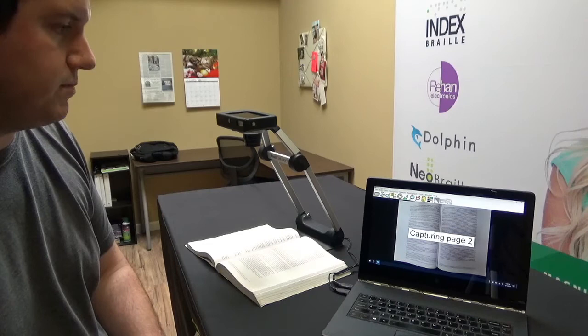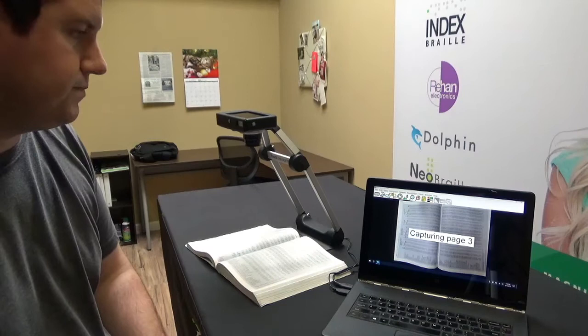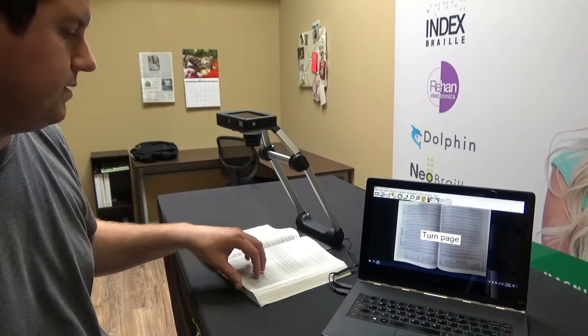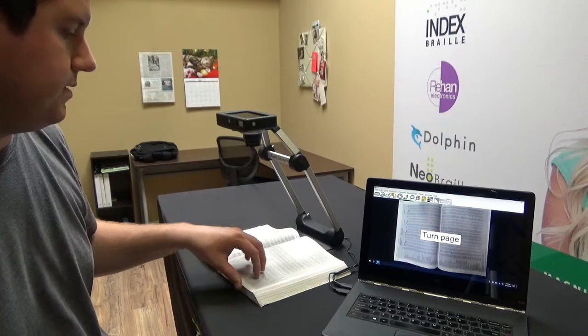So let's capture page one. And it says turn the page so I'm going to do that. Capture page two. Tells me to turn the page again. There we go. We'll do four as the last one.